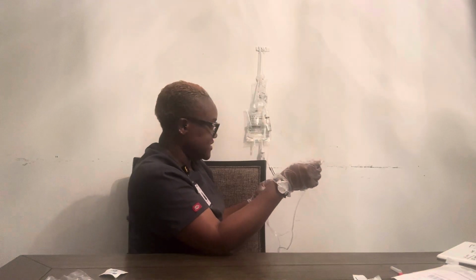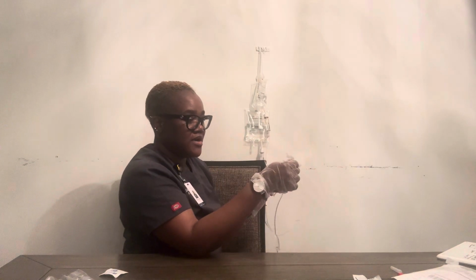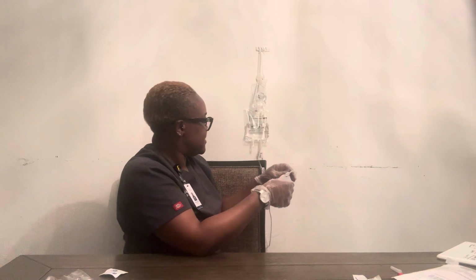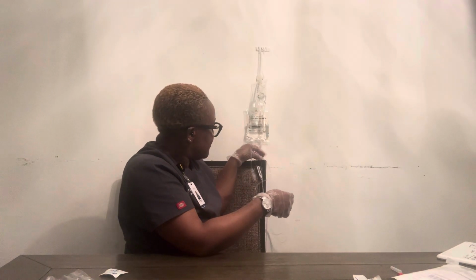Okay, so once this is attached, normally this would be attached to the patient. Now that the medication has been applied for the patient, I'm gonna reassess my patient. I have to double check the IV site.